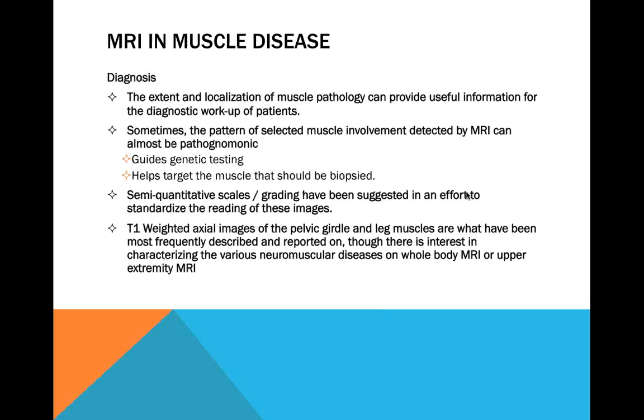So MRI and muscle disease. MRI right now is very great. It's really great for diagnosis. It can help you identify the extent and localization of muscle pathology and provide useful information for the diagnostic workup of patients.